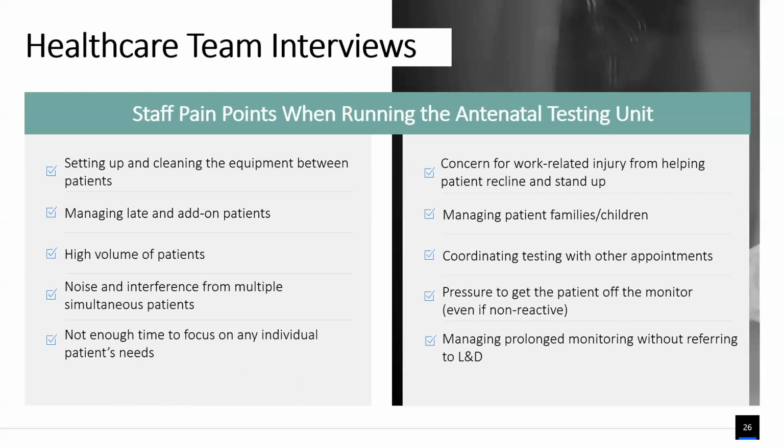Do you use vibroacoustic stimulation? Do you believe that orange juice is going to help the patient? But sometimes some percentage of babies are just not going to be reactive. And you have patients that are getting taken off the monitor before being reactive and having a positive test, and then go into, let's say, a biophysical profile or some more monitoring on the labor floor, even though with just a little bit of time and patience and capacity, you might have been able to avoid that.